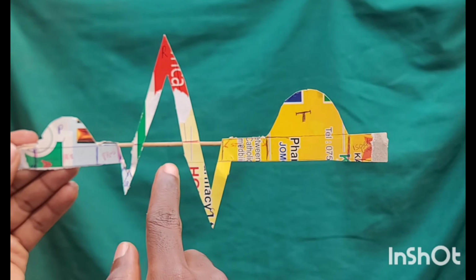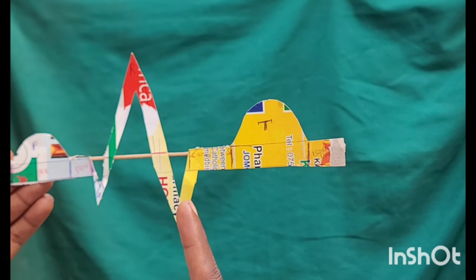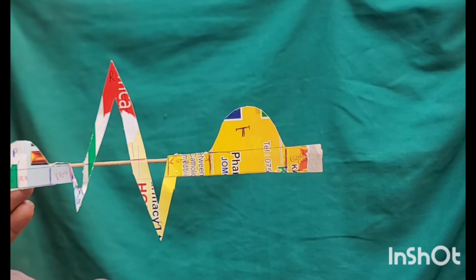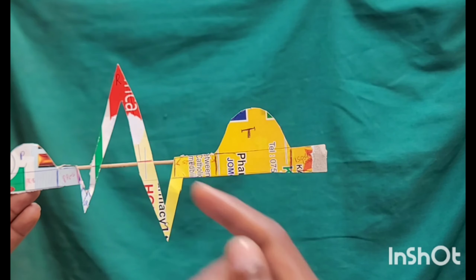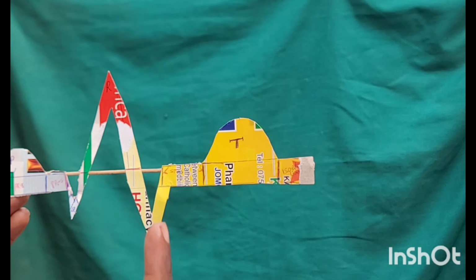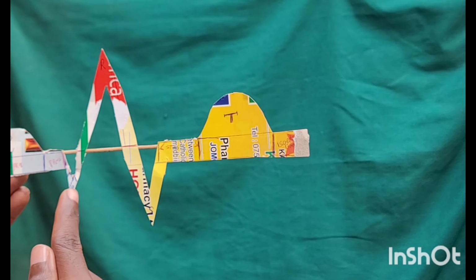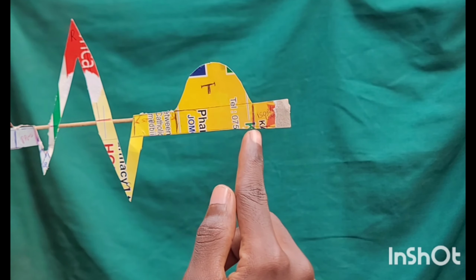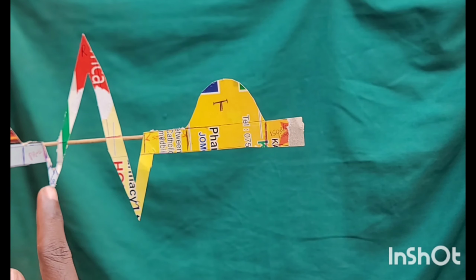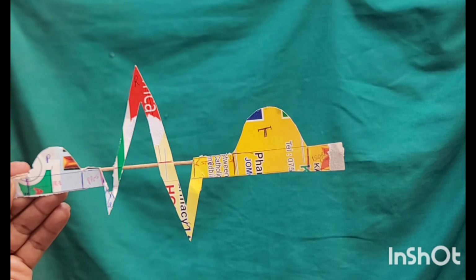Okay. To finish it all, I want to talk a little about what we call the intervals. When we talk about an interval, it combines both the segment and also some of the waves. There are two basic intervals that I want to pay much attention to. We have the interval that runs from the start of the QRS wave complex up to the end of the T wave. This interval, which starts from here up to the end of the T wave, is what we call the QT interval.